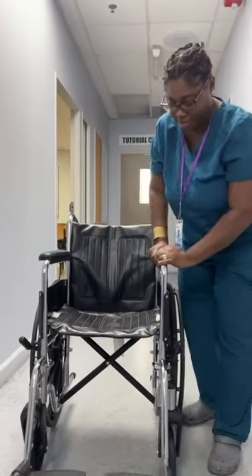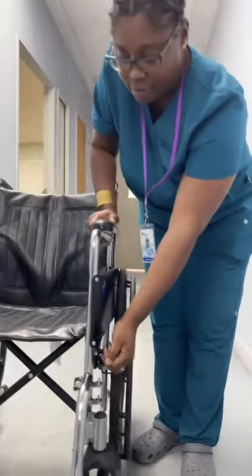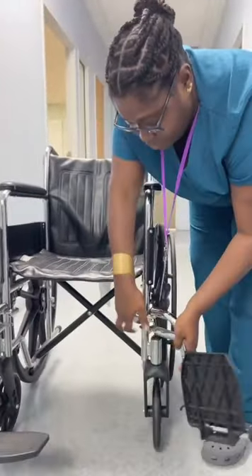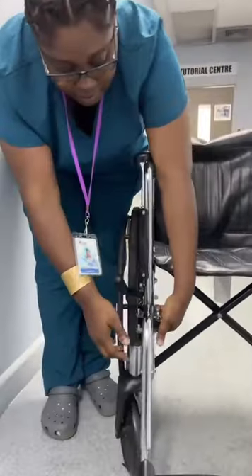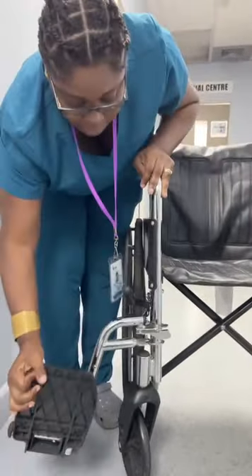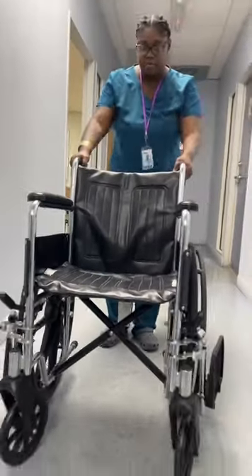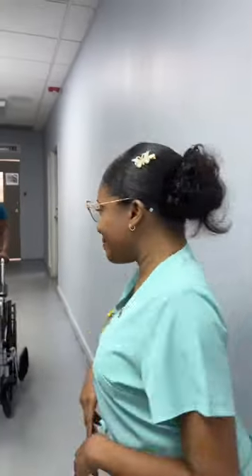We are ensuring that the seat is safe and make sure that it's clean. Make sure the adjustable parts are properly functioning. Good. So we're going to approach our client now.